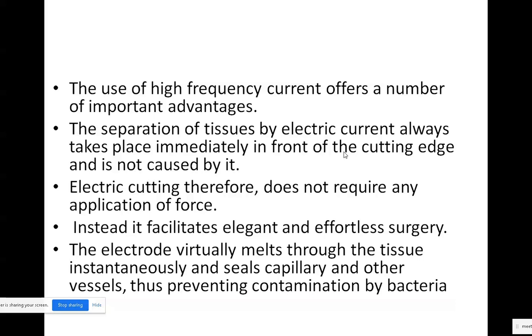So by using a high frequency signal, you may give treatment only for the affected area. The remaining tissues will not be damaged. By providing the high frequency signal, it may isolate the other tissue parts. That's the first advantage.